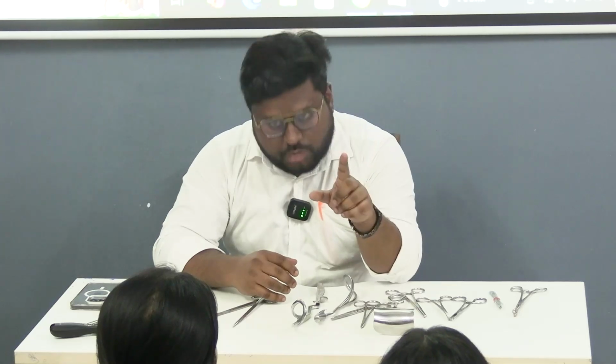Now the suture material. First we suture the uterus. Uterus is sutured by Vicryl. What is Vicryl? Absorbable poly. Vicryl আসল নাম কি? Vicryl তো কমার্শিয়াল নেম। Polyglactin 910. Polyglactin 910 is the generic name of Vicryl.